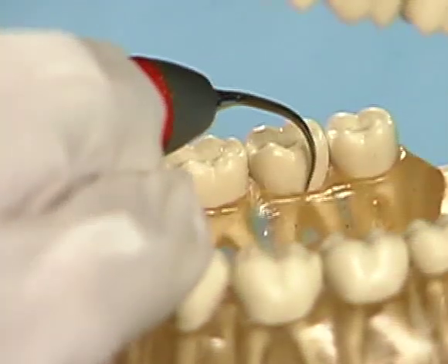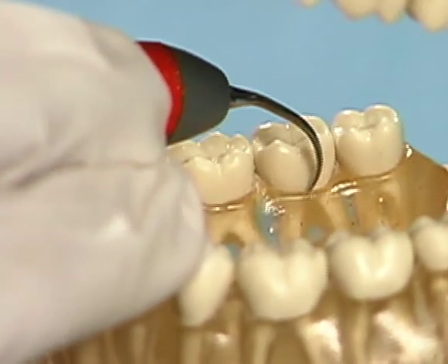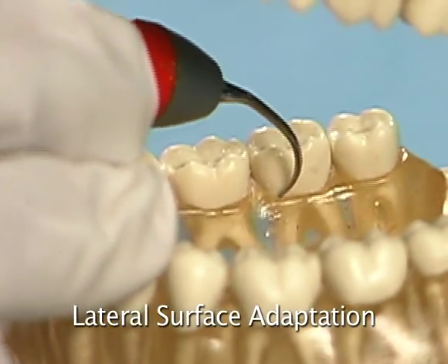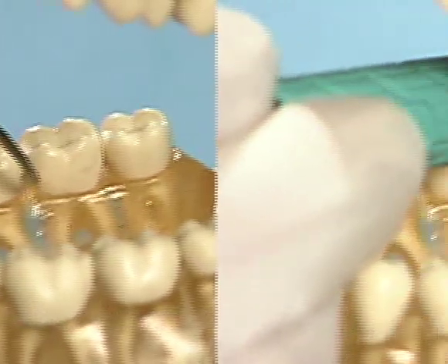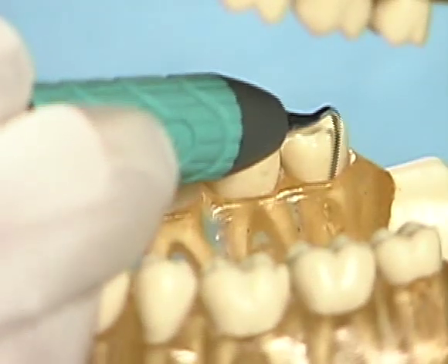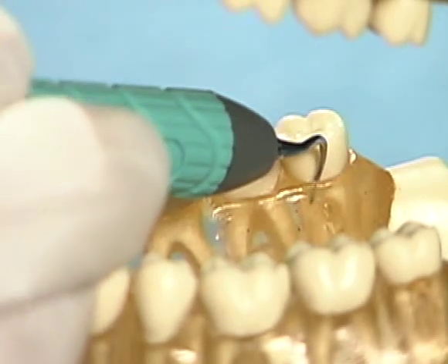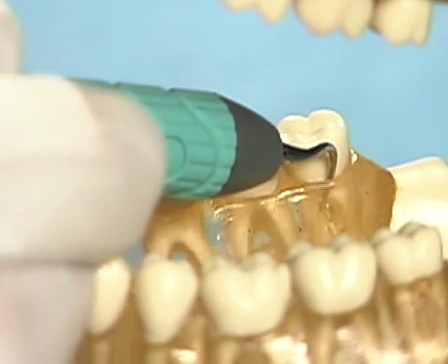Because all sides of the magnetostrictive tip are active, two distinct approaches to instrumentation can be used based on the surface of the insert which is adapted to the tooth. Either technique is acceptable when using a magnetostrictive insert, allowing the clinician the versatility to modify adaptation of the insert to meet the clinical situation.